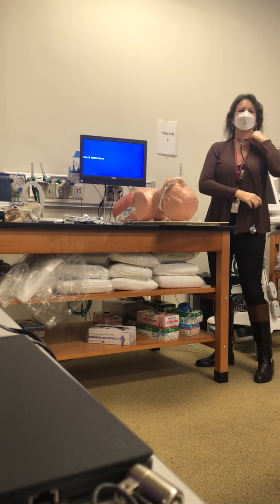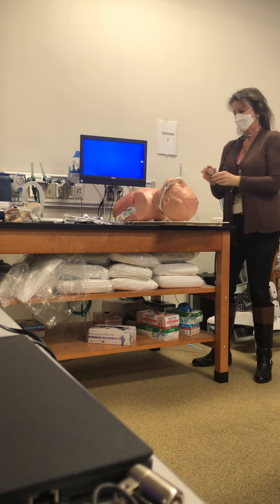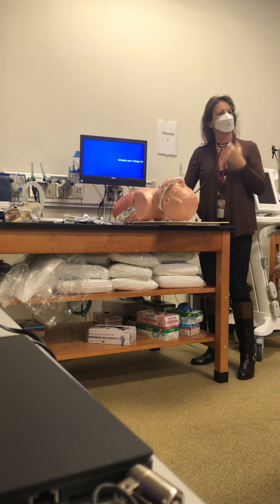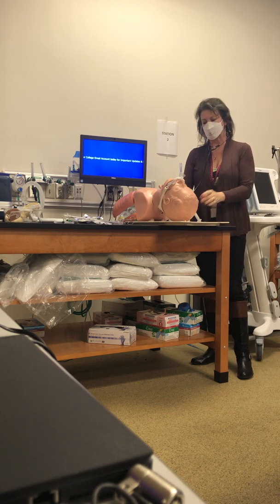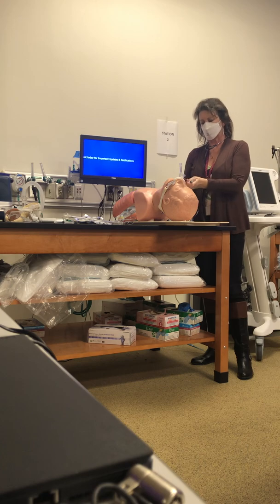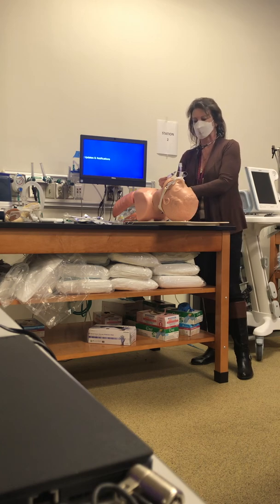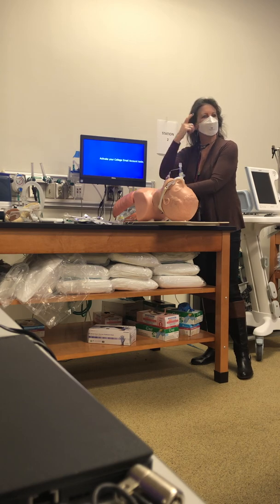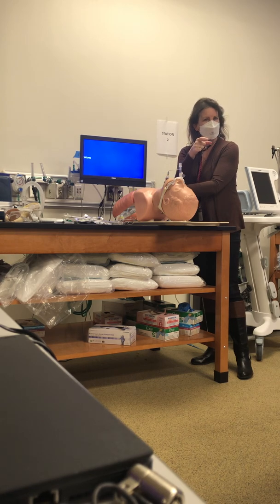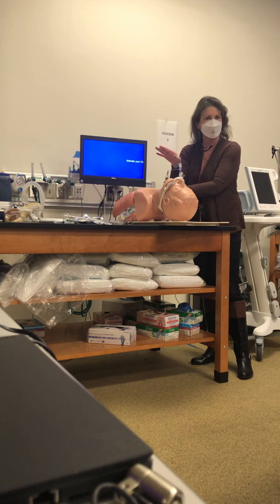So I'm gonna listen. I'm not putting them in my ears because I didn't clean it. But we're gonna listen here, right where the cuff is, right? Right in the neck, where the cuff is. Okay, so we're gonna listen here, and we're going to release. As we're listening, we're gonna release enough air out of that cuff, okay, until we hear a leak, gurgling. So we hear a leak. It's not sealed anymore. There's a leak, okay? So we want just enough pressure to seal that leak. That's it. We don't need any more pressure than that.